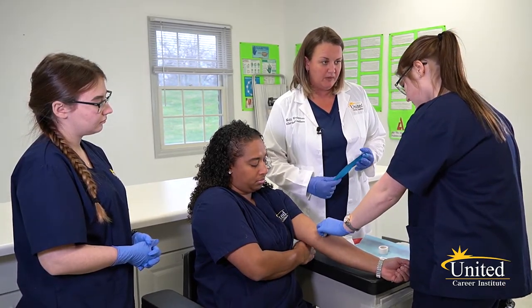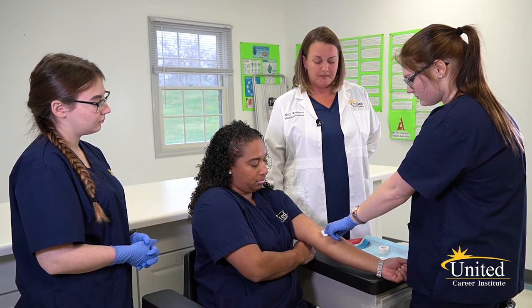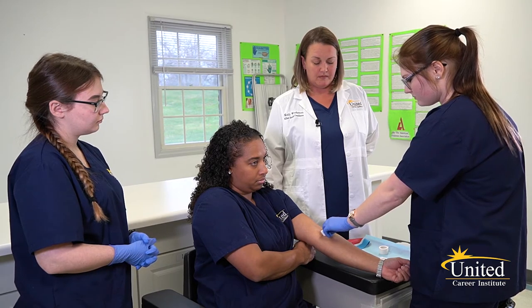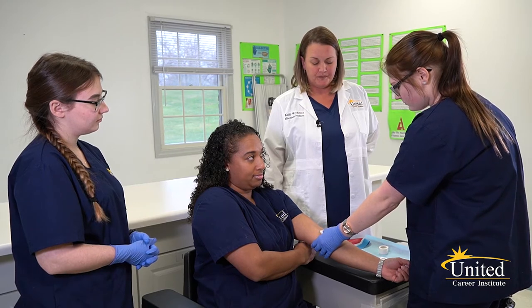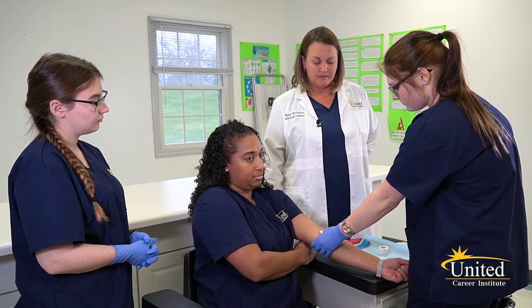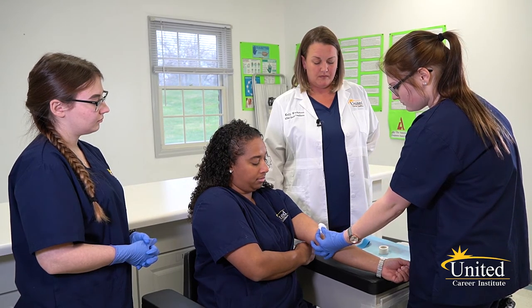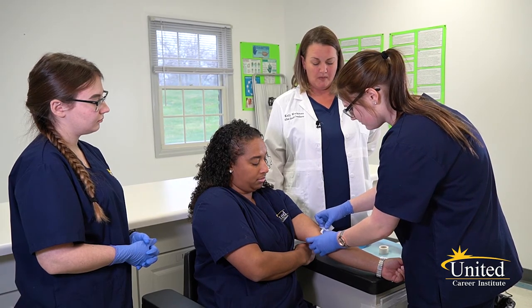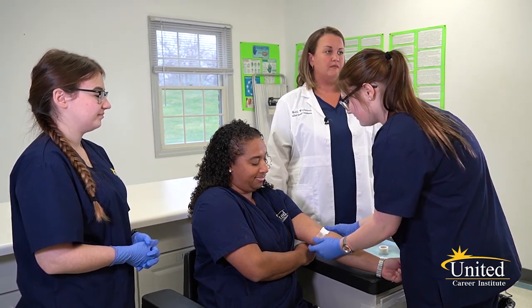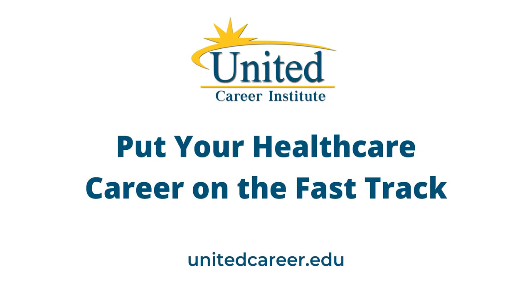Make sure your patient is done bleeding before you apply the tape. You can apply pressure. Good job.